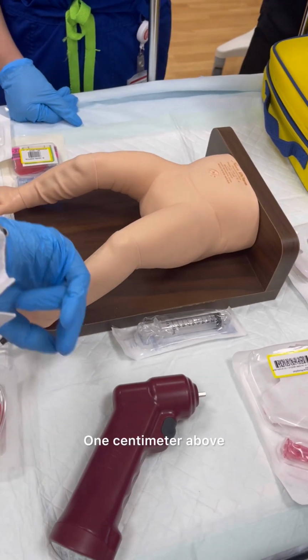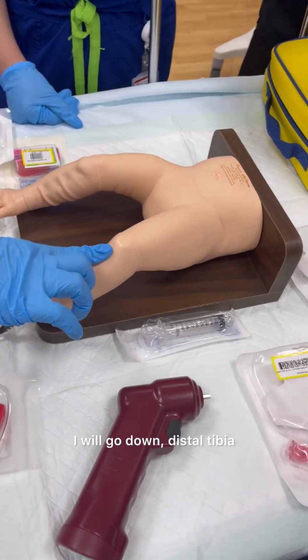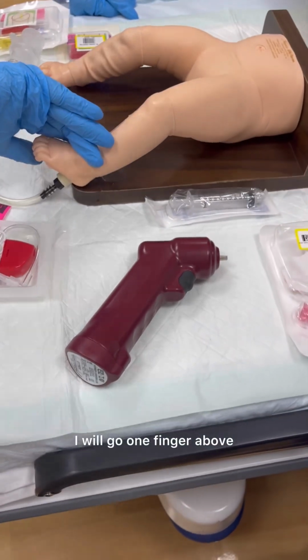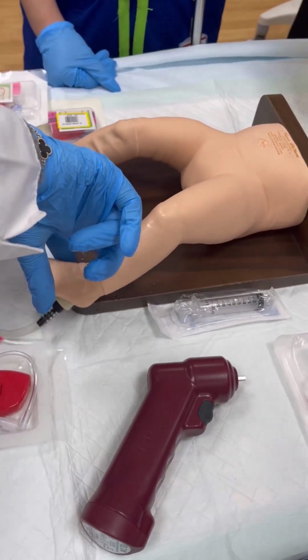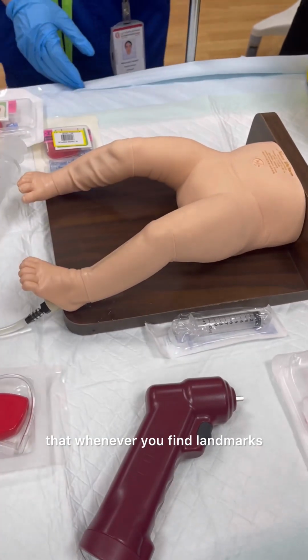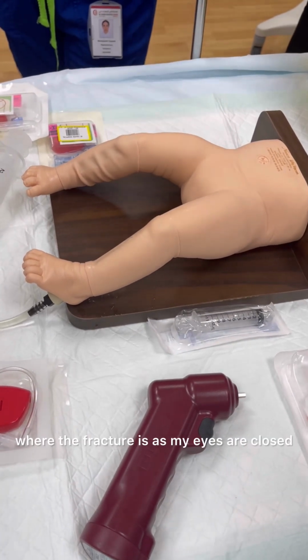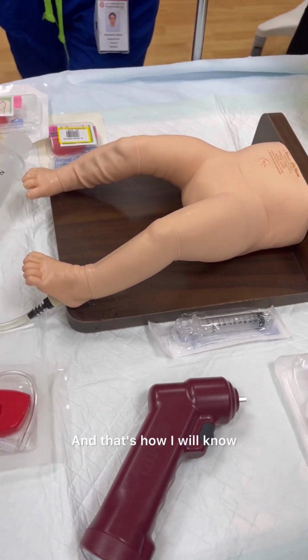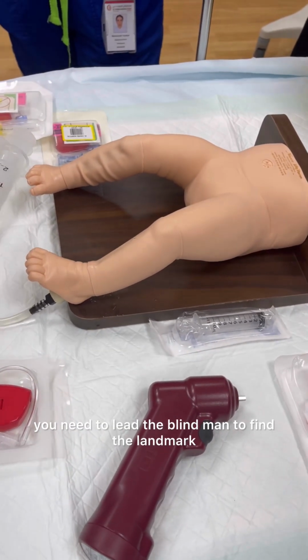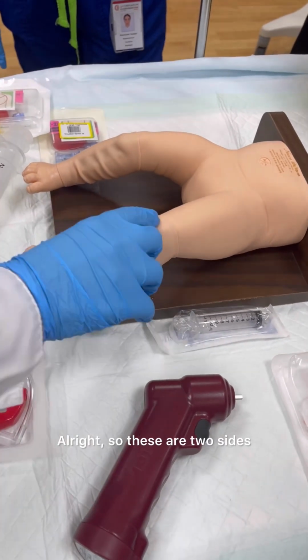One centimeter above. So again, this is the knee of the child. My eyes are closed. I go down to the distal tibia, then I find the medial malleolus. Once I find the medial malleolus, I go one finger above, and I go in. Understood? It's very important. I used to have a professor who told me, whenever you make an ortho consult, tell me where the fracture is as if my eyes are closed. When you're defining landmarks, you need to lead the blind man to find the landmark. If it's clear in your brain, it will be clear in everybody's brain.